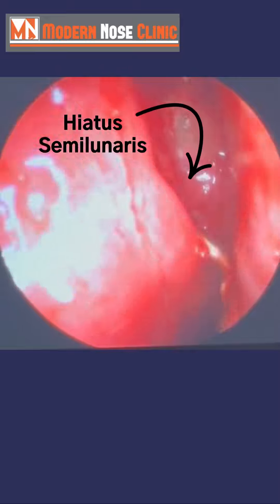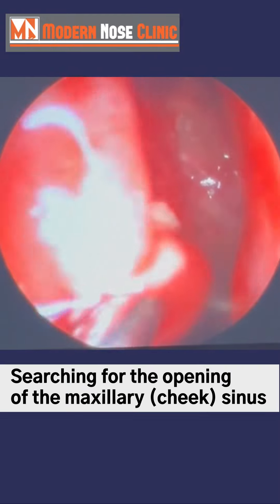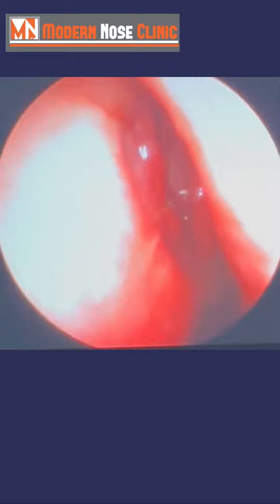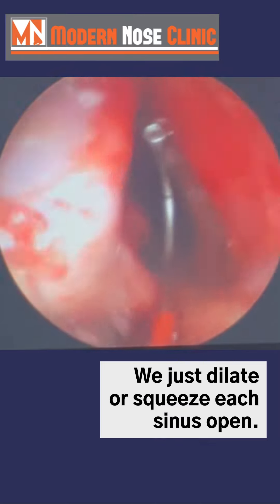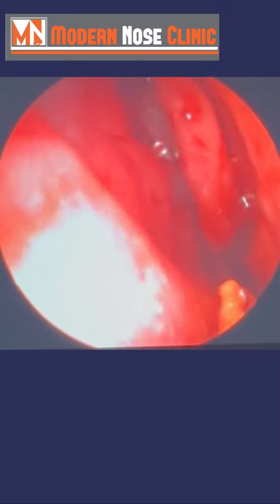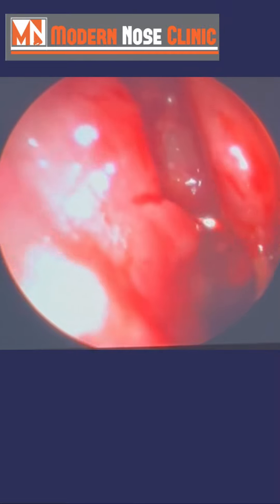We're going to try to find where the infection is. There's some infection right in here. Now we're going to put the balloon into that area and we will get it to open. We have bent this into a different configuration — same device — and it's got kind of a curve in it now.